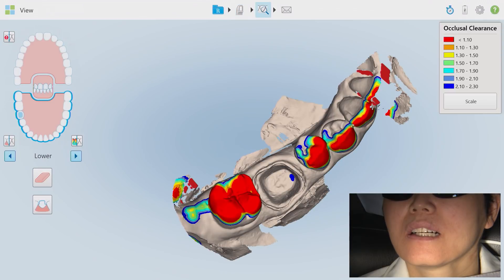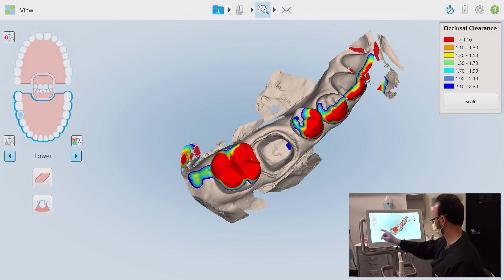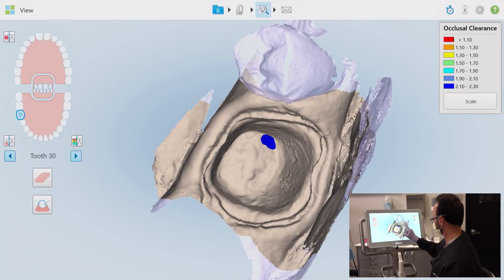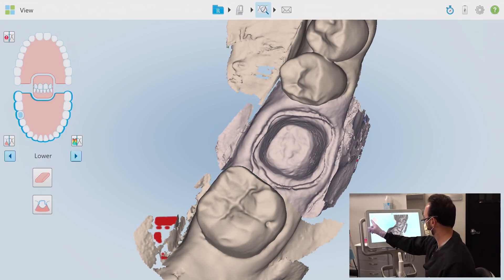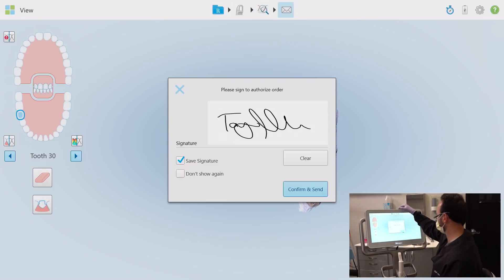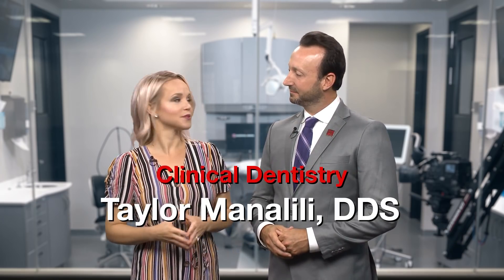I'm really happy with how little time it took to clean and produce this model. I attribute this mostly to my ability to acquire information in the shortest amount of time — 6,000 frames a second is a lot of information to process. As your scanning skills increase, the overall processing time will begin to decrease. These color codes overlaid on the arch can be used to show the clinician the occlusal clearance and assist in making decisions about restorative materials or refinements. By selecting different combinations of the arches I can get a good look at every angle before sending it off to the lab or to the practicesglidewell.io in-office solution for a complete in-house same-day case. Thank you for that, Will — your patients and your lab are going to love you for it. That wraps it up for today's episode — thank you so much for watching and we'll meet you right back here next time.